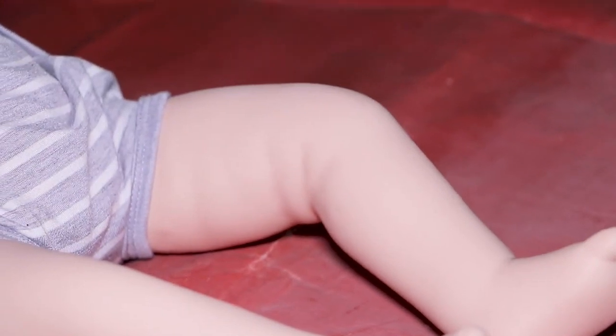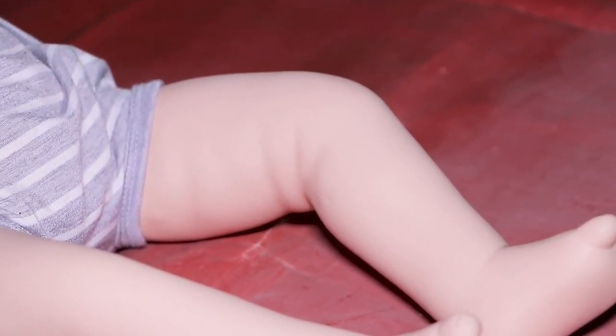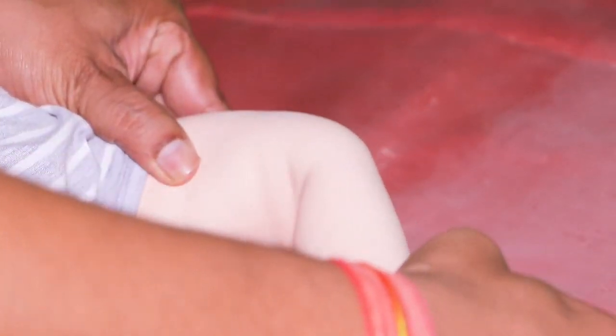Next, it's important to get the child into the correct position. Flex the child's leg at the knee and ensure the leg is stable. You may need an assistant to hold the leg.